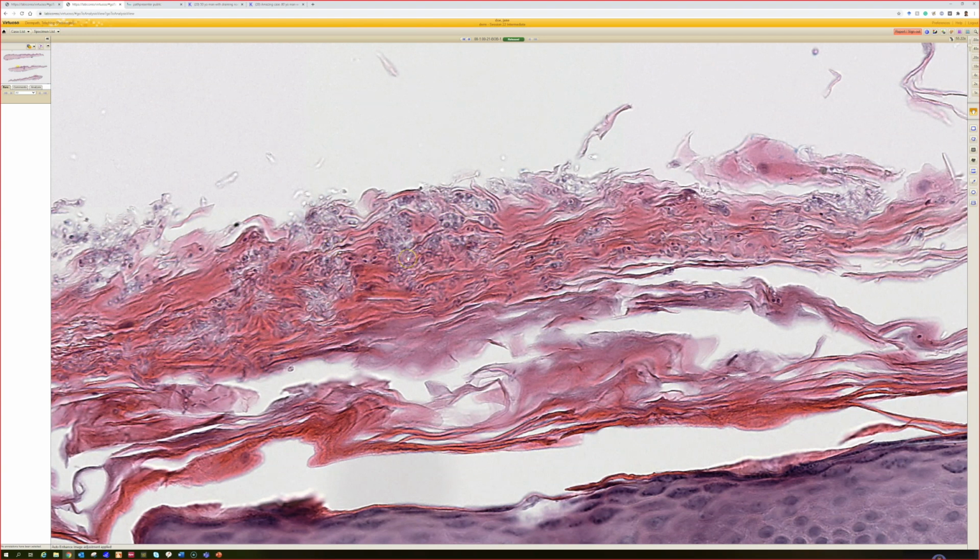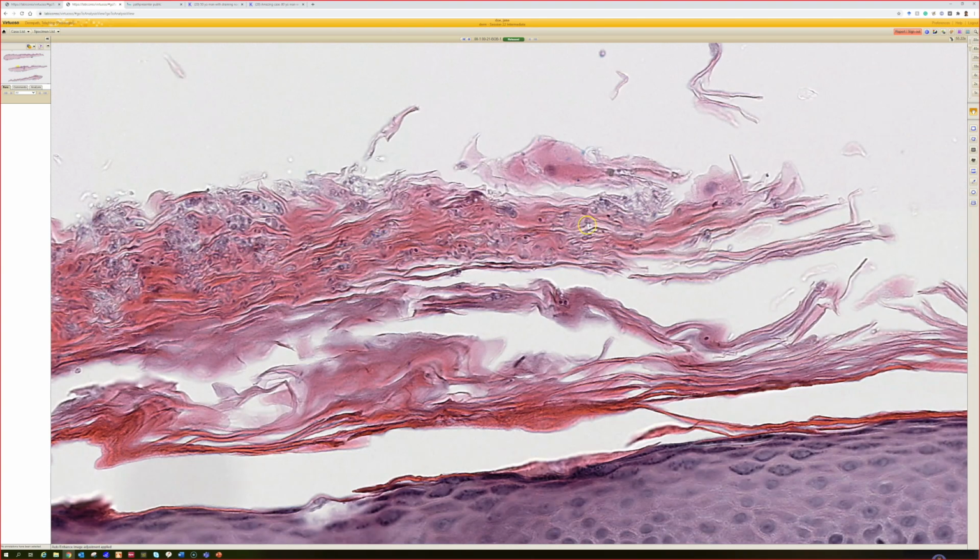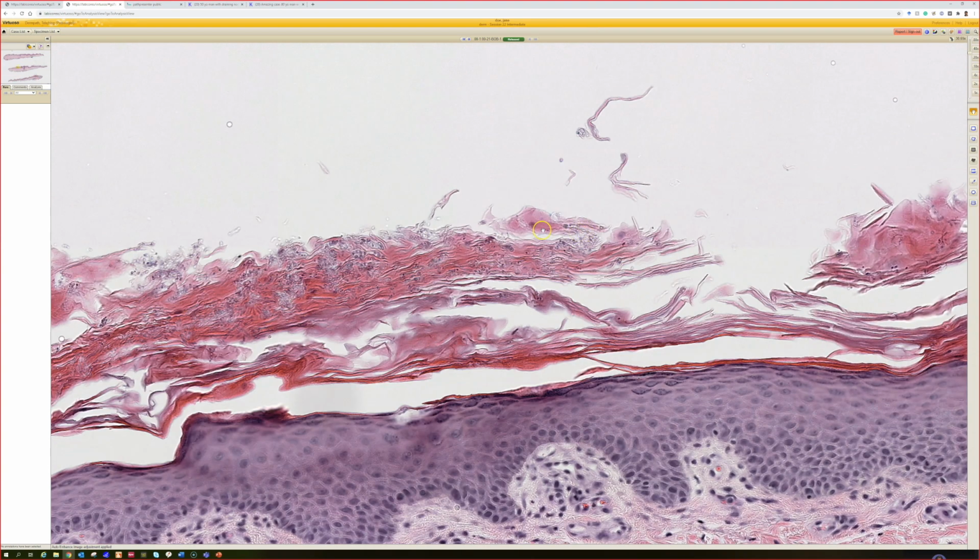When you just see the yeast, some people have proposed that this means it's just commensal. I see just Malassezia furfur, Pityrosporum ovale, whichever name you like. I think Malassezia is the current name, but Pityrosporum has such a nice ring to it. When you see the little clusters of the Malassezia or Pityrosporum yeast in the openings of hair follicles or in anything where there's thick keratin, like over the top of seborrheic keratoses, I see this all the time. And I don't even mention it because those are just commensals growing on the skin surface.